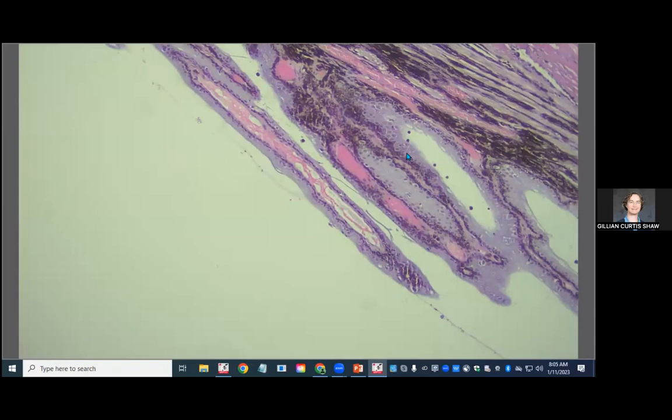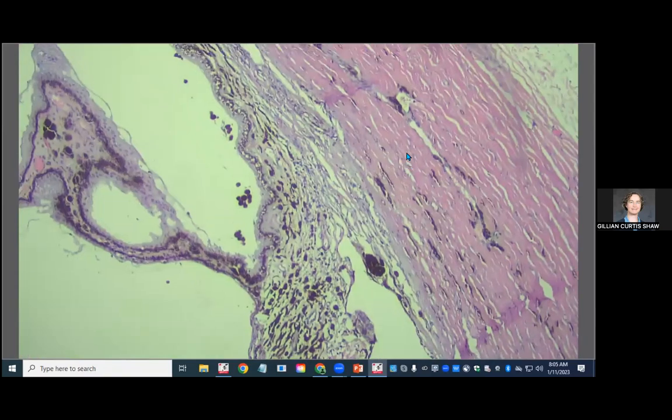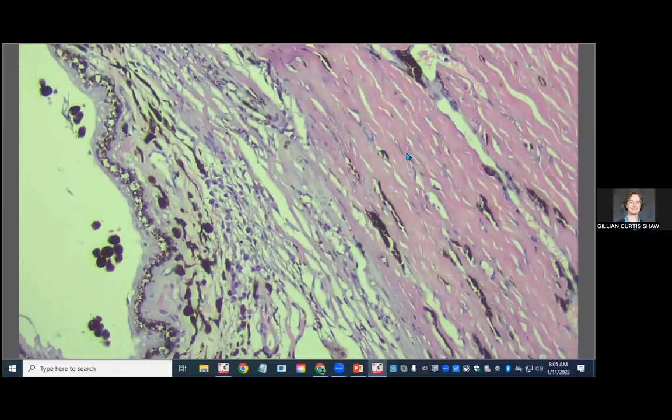The other thing I wanted to show you, and this is extremely subtle, and you may or may not be convinced that it's true, but that's okay, is if we go closer, in the trabecular meshwork, in places like this, we have that same homogeneous, glassy to wispy eosinophilic material. It's taking up some space in the trabecular meshwork. And that is essentially all that's happening in this globe.